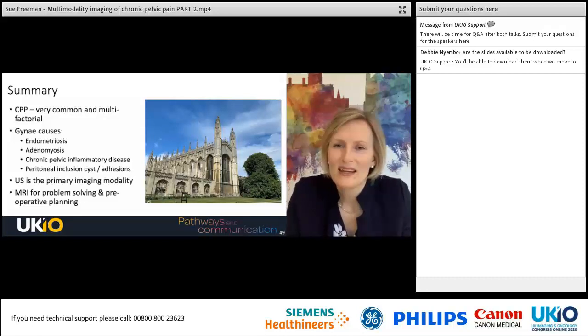So we have discussed chronic pelvic pain as a common condition, and that it is often multifactorial, looking specifically at the gynecological causes, but we must acknowledge that there are other causes of chronic pelvic pain, including bladder and bowel pathologies and many others. It's important that we use ultrasound to explore the possible origins of the pain, and MRI is there for problem solving and preoperative planning. So thanks very much for listening.